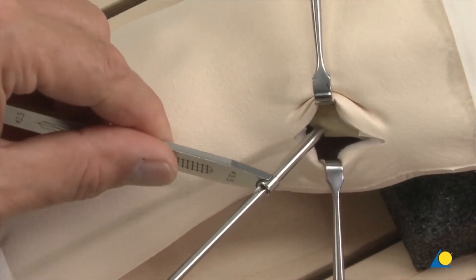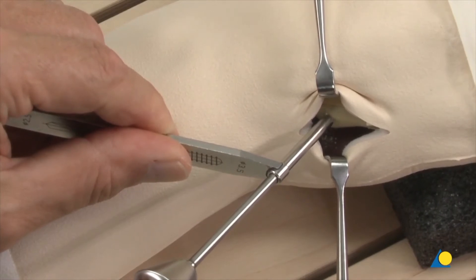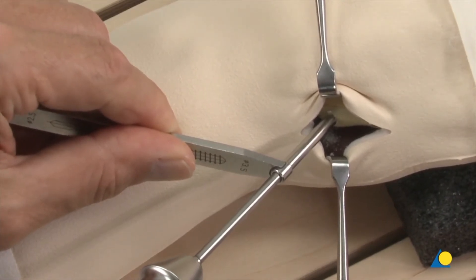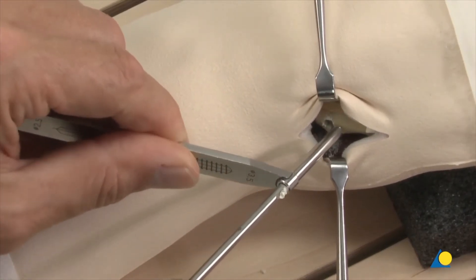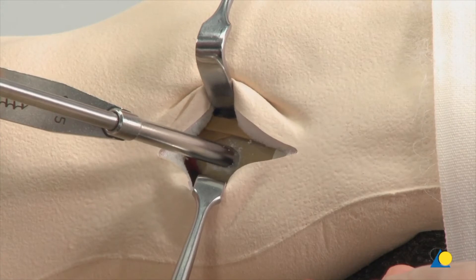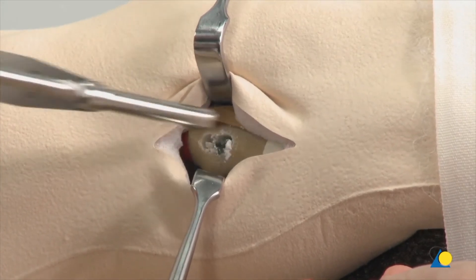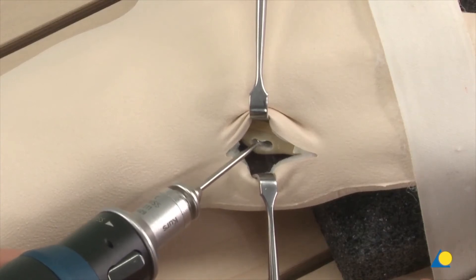At the base of the metacarpal, two oblique 3.5 mm holes are made as far as the medullary canal from proximal ulnar to distal radial, but not through the opposite cortex. The holes in the cortex are then widened with a round burr.